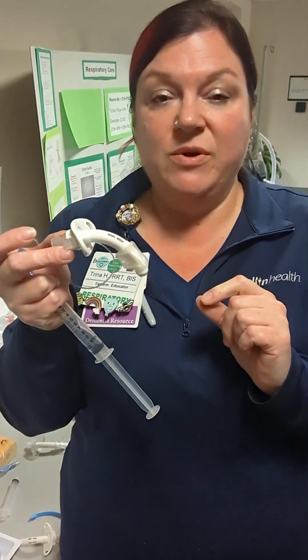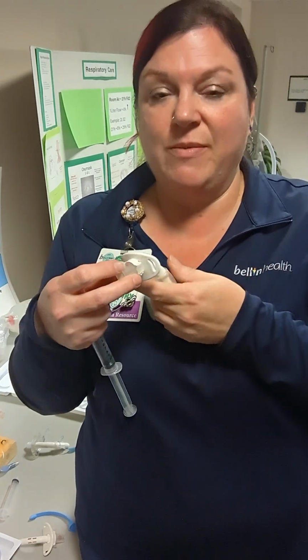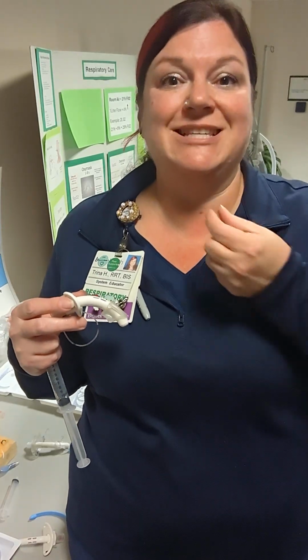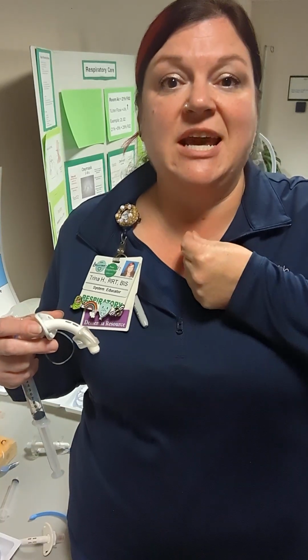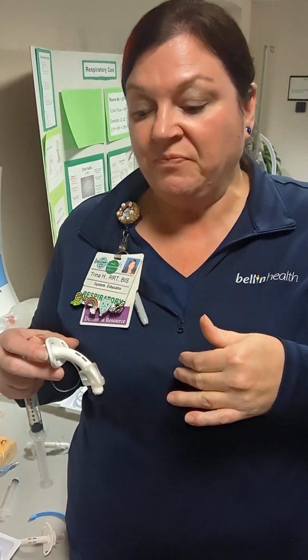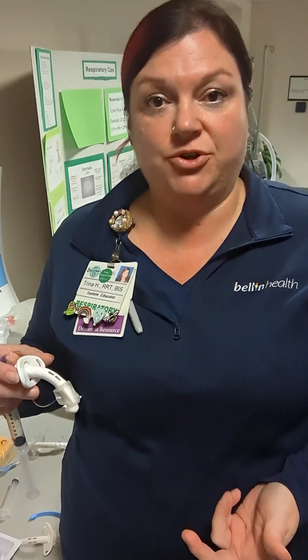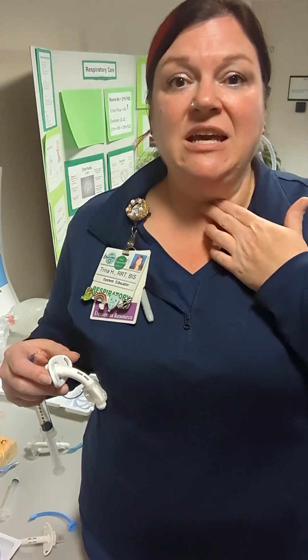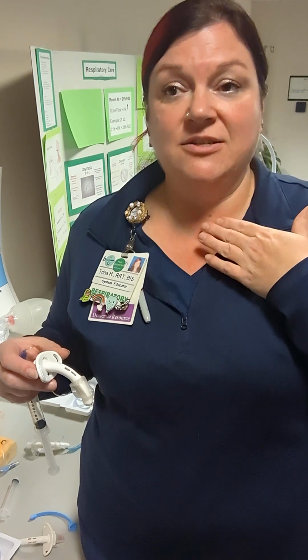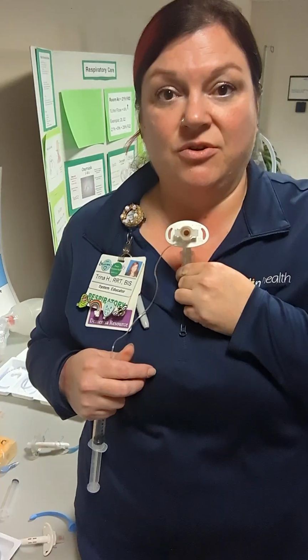Okay, and then we might do a tube exchange. So we might downsize our trach. So we might go from a 6 Shiley to a 4 Shiley. And those numbers are telling us the size of the trach itself, because it requires tapering to get it in. And so we taper to let it heal. So we'll downsize our trachs until we're ready to decannulate, meaning remove the trach altogether. The hole that's left in their neck is called a stoma. If there's an artificial airway placed, that's called a trach.